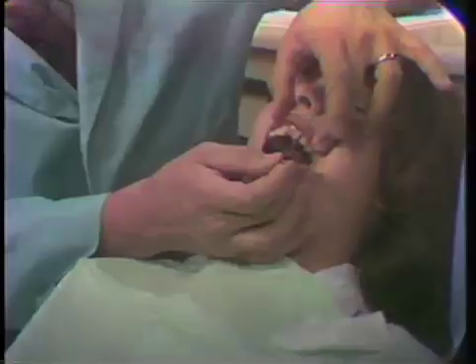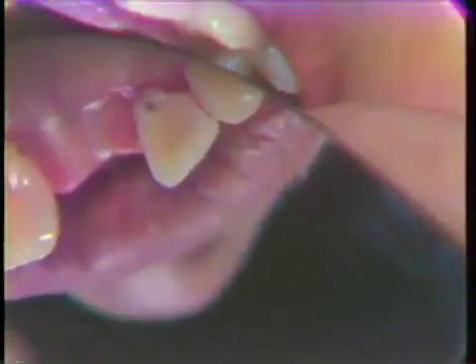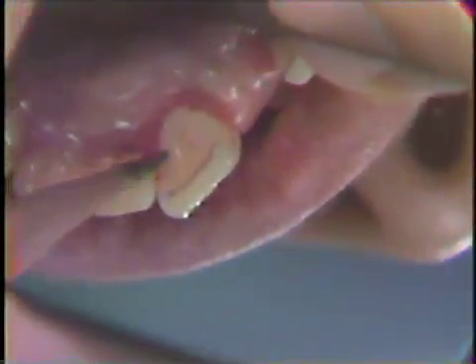We're going to use a Bowley gauge to establish the position of the ledges on the pinledge preparation. We set the Bowley gauge at two and a half millimeters and scribe it across the tooth. This means that the tooth is two and a half millimeters wide at this point. If we take a half a millimeter off the lingual surface in reduction, make our ledge a half a millimeter, this means that we have a millimeter and a half of tooth structure left — the amount needed to keep the gold from showing through.